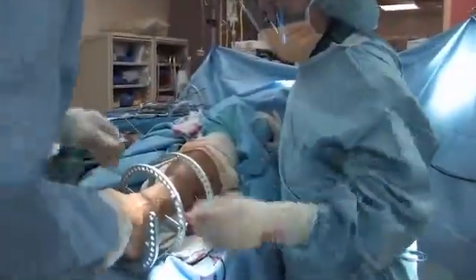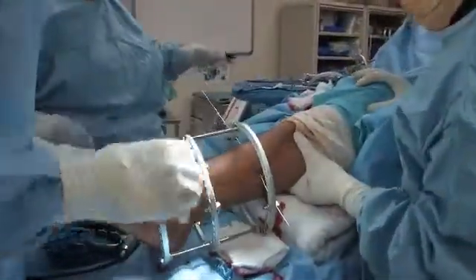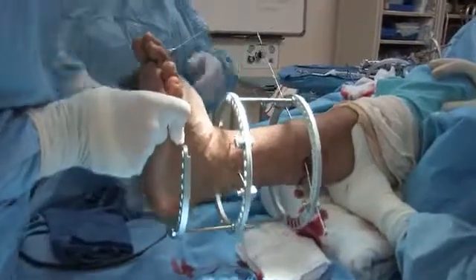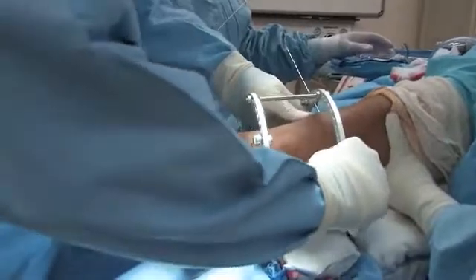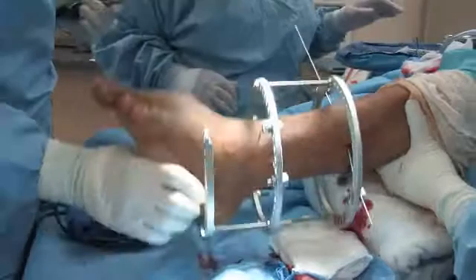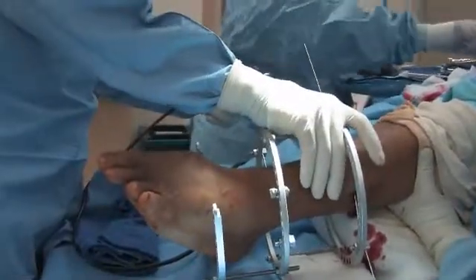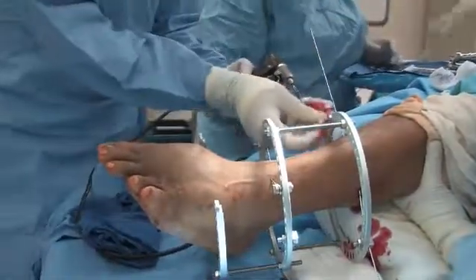So now we'll put in our second wire up in our proximal ring. Again, we've not burned any bridges by positioning. We can adjust anything we've done at this point still. We are going to now go from medial to lateral. Again, my reference point is the posterior surface of the tibia. We want to be anterior to that. It keeps us out of our danger zone.